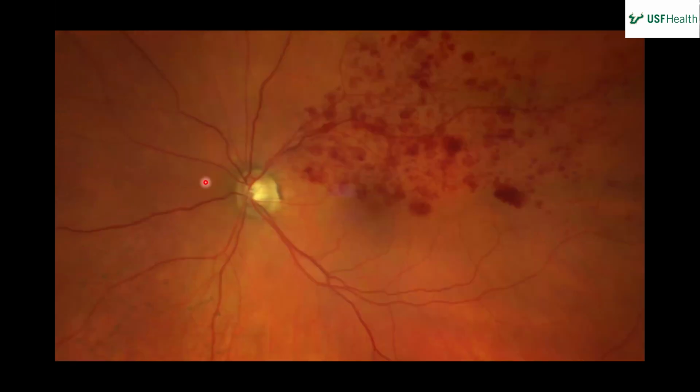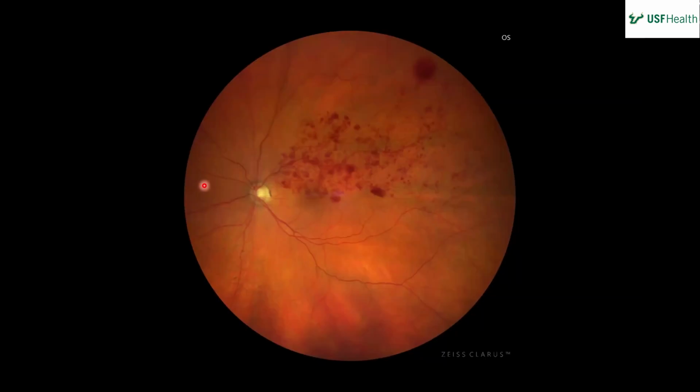Okay, sounds good. So vitreous clear, nerve looks symmetric to the other side, sharp, pigmented temporal crescent. Attention's drawn to the large area of what appears to be intraretinal hemorrhages that follow the superior arcade and stay relatively superior to the macula. Otherwise, retina appears normal. And then we have a wider field view that shows the intraretinal hemorrhages extending out along the arcade and then a larger hemorrhage in the supratemporal area. Doesn't look like any surrounding fluid though. No tears or detachment. Very good.